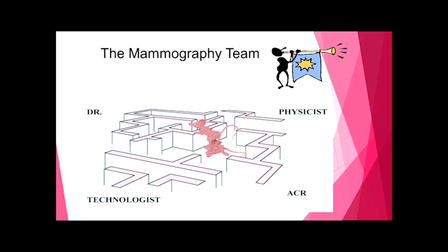But what we hope has occurred, and one of the original intents of MQSA, was to develop a mammography team, a group of players that weren't isolated from one another, and a program that had all of the major personnel groups participate, so that the overall image quality could be evaluated and then ultimately improved.